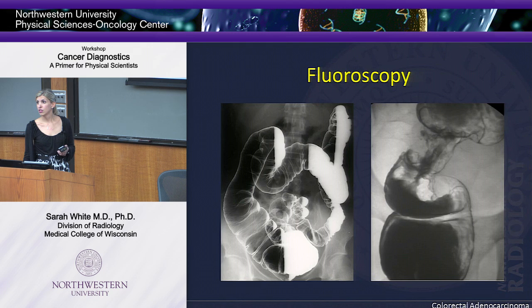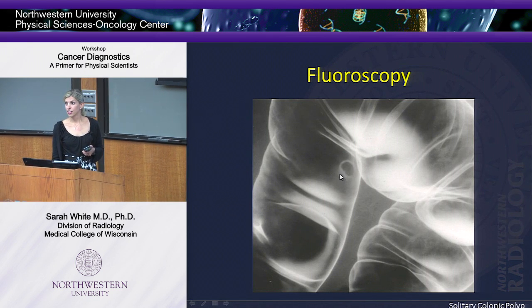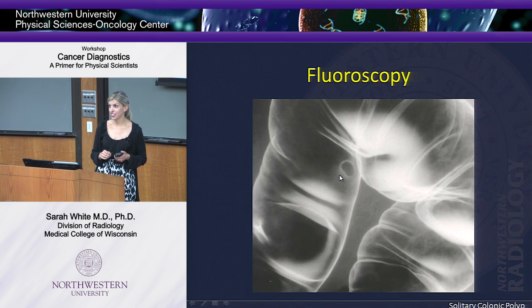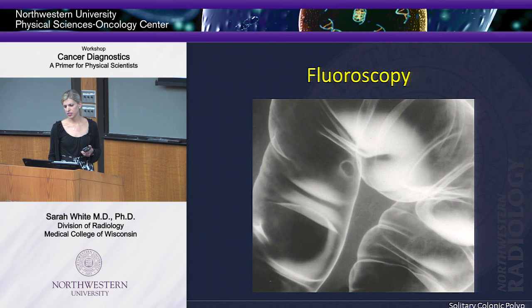Excuse me, what's the scale of that picture? This tiny thing, what's the scale? Yeah. Oh, it's really magnified, so you can see it. It's probably 20 times magnified. It's pretty big. So that's probably a 1 centimeter lesion.